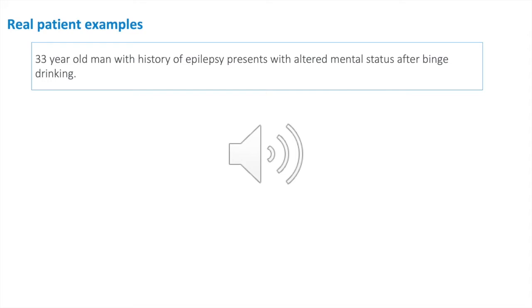The sound was loud, repetitive, continuous, and not a flat tone. That's why this was very concerning for seizure.